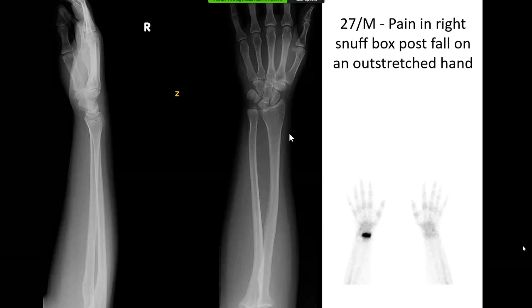In Australia, we often do a lot of bone scans for indications which may not be the mainstream indication, which is basically a radiologically occult fracture. We don't do it in an immediate setting. Remember that if I do a bone scan within 24 hours, I get a false negative bone scan because abnormal uptake may not be seen.